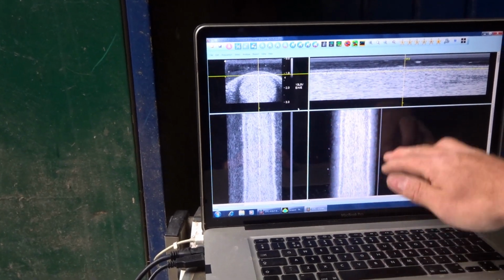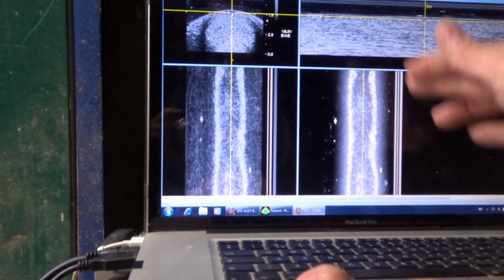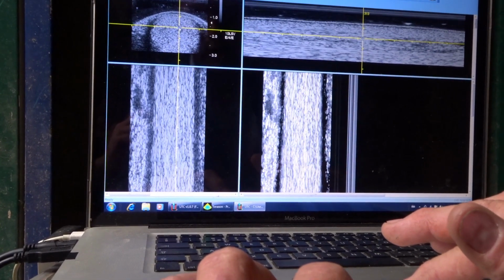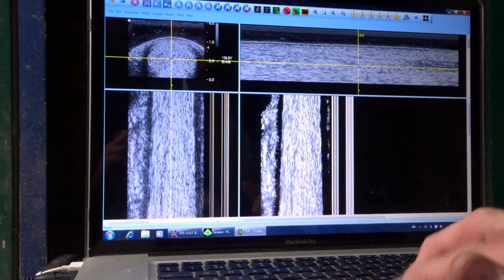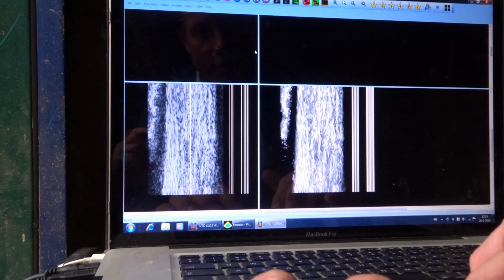Here we see what they call the surgeon's view. If you would stand behind the horse and you would cut the skin open, this is the image you're going to get. The tendon sheath opens, we look into the tendon now, and we can scroll through the tendon again in a three-dimensional manner. That will give us a lot of information on how lesions and abnormalities live in the tendon.